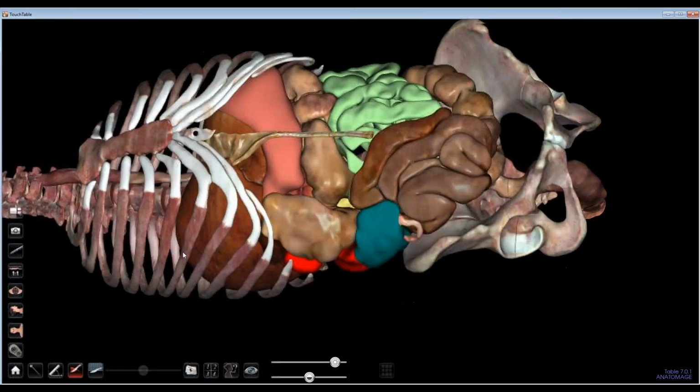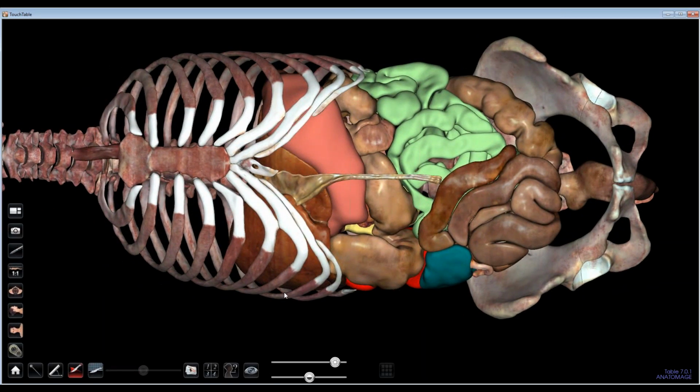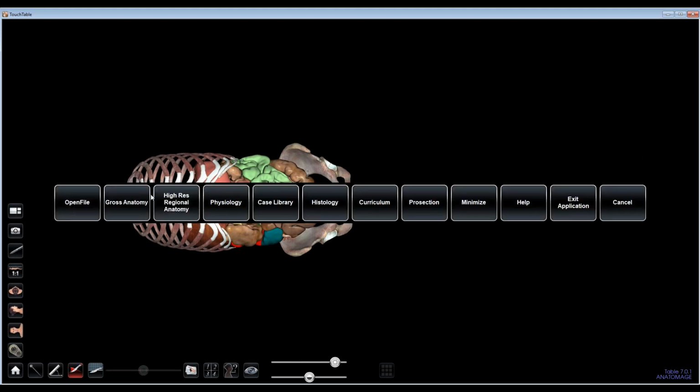So start practicing with the visibility menu, start practicing with the presets. We can certainly set up another online training with you and your teachers and other users and go through something like this again, or if there's other things that you want to go through, other content in the table, one of these other main sections, we can certainly do that.